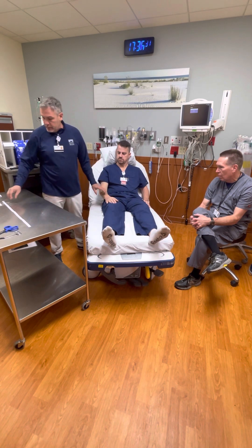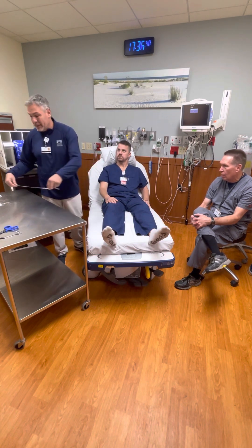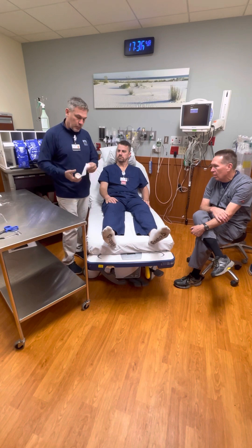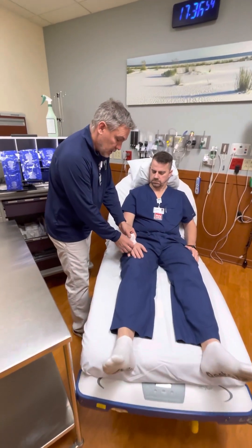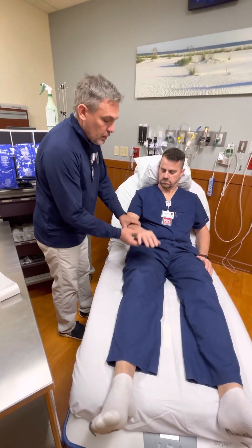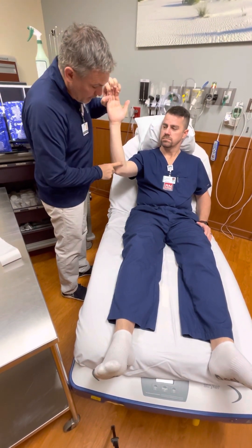We want to measure how far or how long our material needs to be. You can use one of the measuring devices, but I typically don't - just saving a step. I grab some of the material, the web roll, and measure it on the patient. I'm going from behind the fingers where he can still make a fist around my finger - from that point going down.